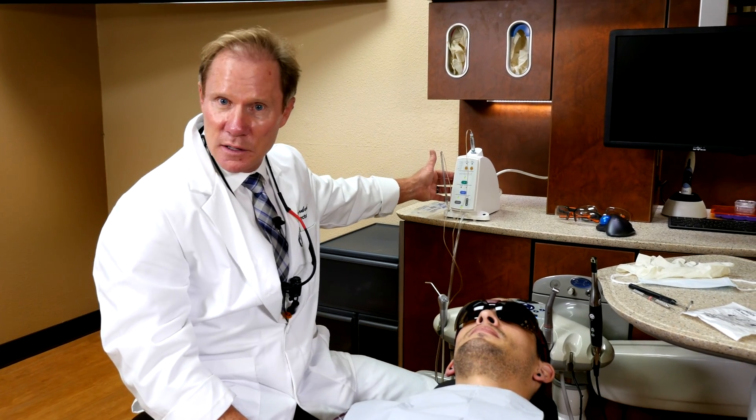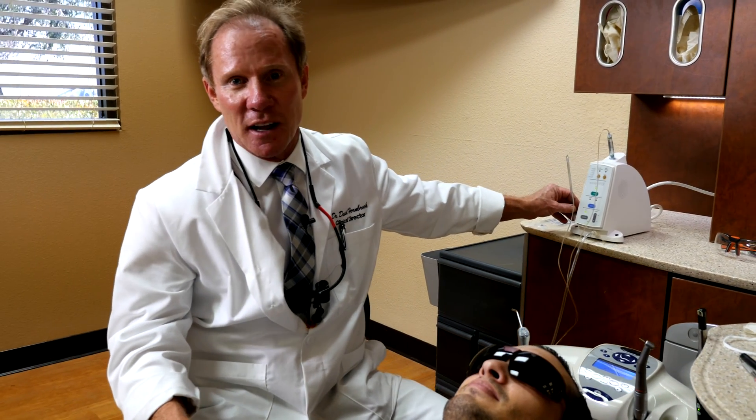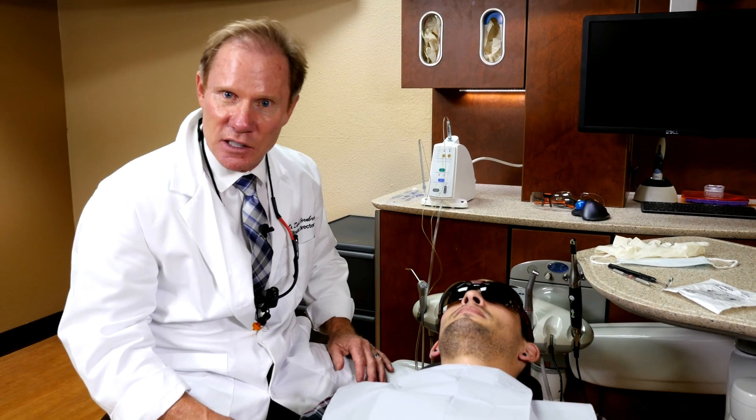Today we're going to talk about the WAND. This came out over a decade ago. It was originally called the WAND, then the WAND II, then the Compudent, then the STA, and then they renamed it last year back to the WAND because of the familiarity with that name. STA stands for Single Tooth Anesthesia.